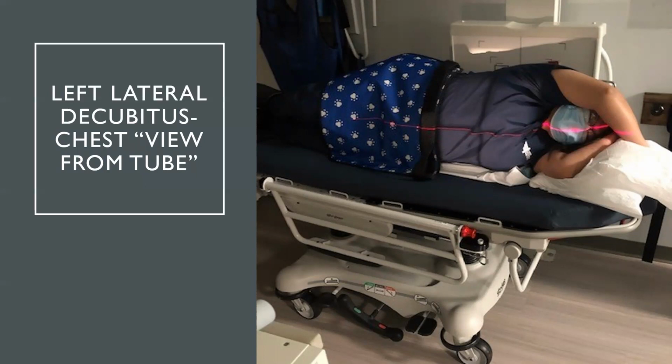Collimated field size. We will have open collimation to ensure we have the apices, entire lungs, and the costophrenic angles. So it will be 14 by 17. Visual of appropriate marker location. The marker is located behind the patient's shoulder, and it is the right marker that is marking it. KVP range for a real patient is usually around 110 to 125 KVP.